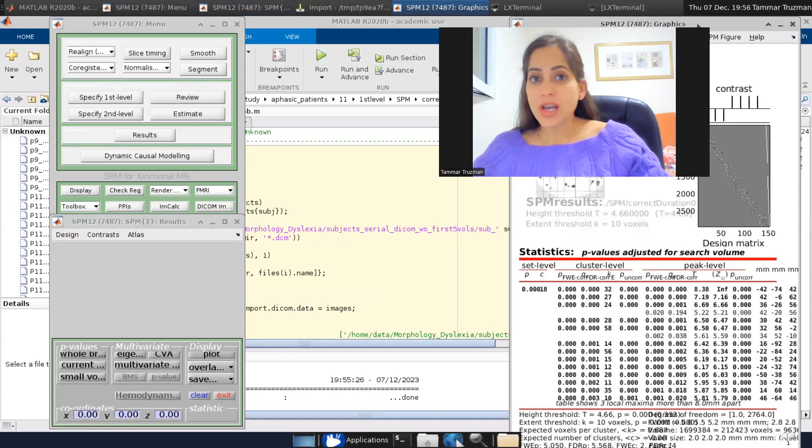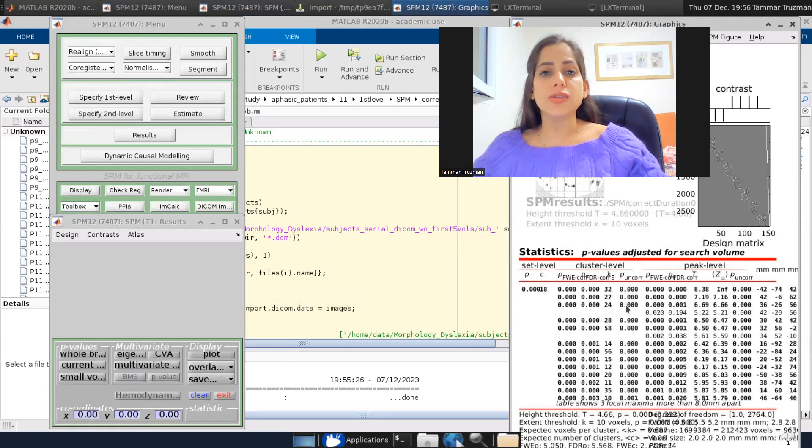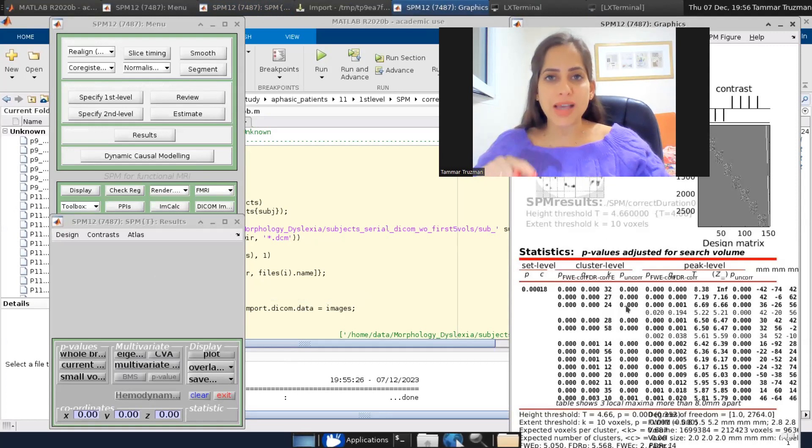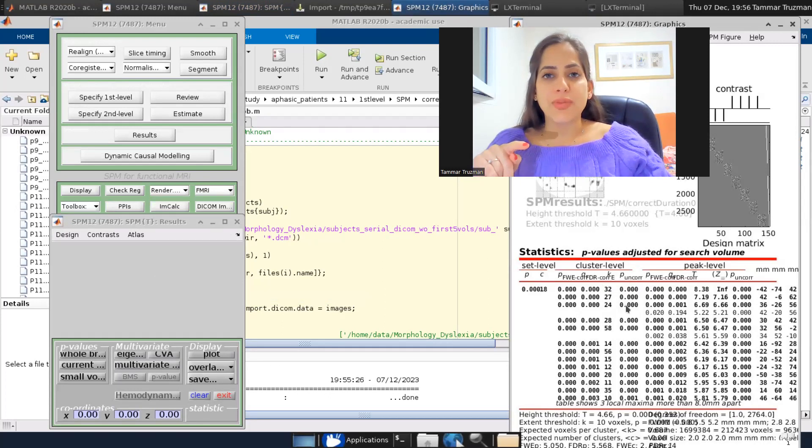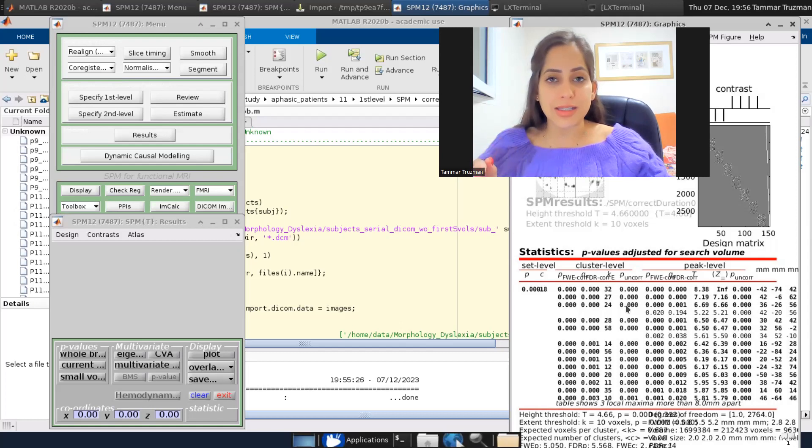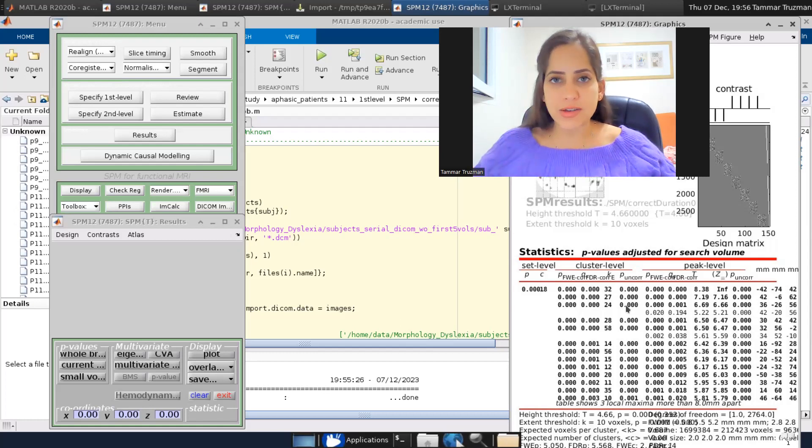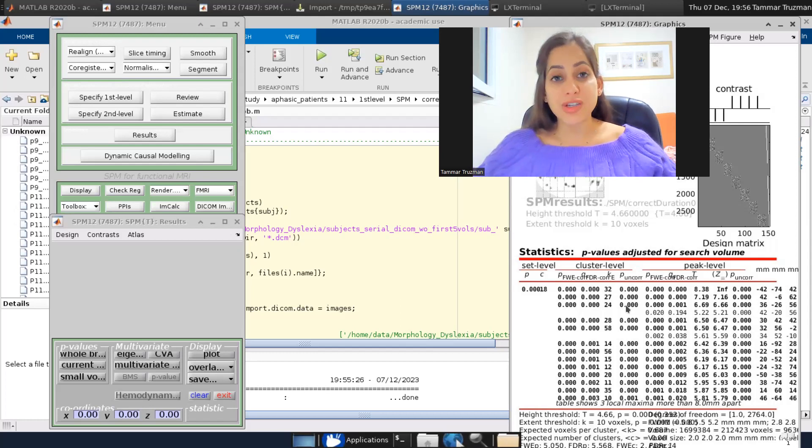But we are not done yet because here what I see is all the voxels in all the brain that passed this threshold of T, high threshold T equals 4.66. But in all the brain, I didn't correct for anything. I just chose an arbitrary threshold.